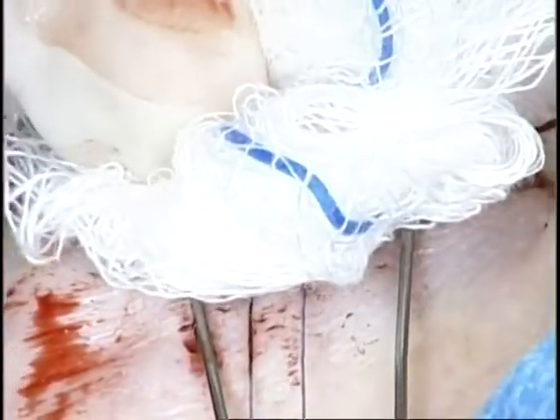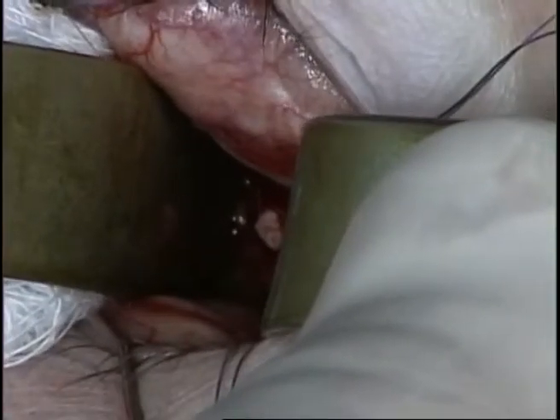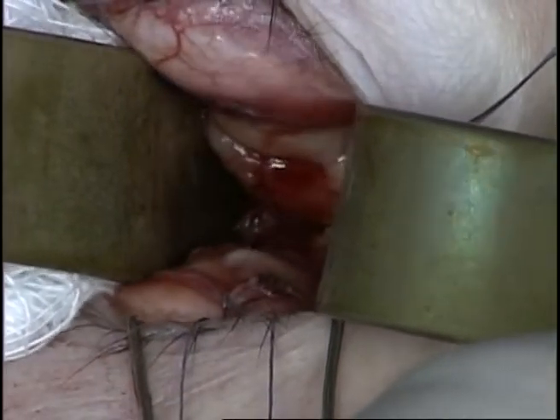The socket is then packed with a 4x4 gauze for 5 minutes. Inspection of the socket for any residual bleeders shows the transected optic nerve.